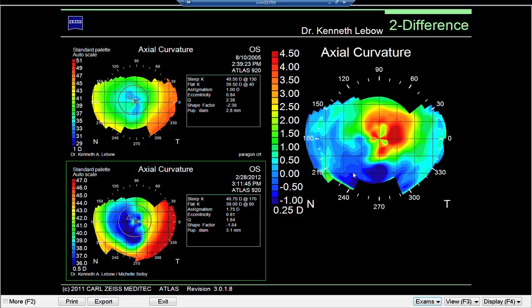This individual had refractive surgery, and the result of the refractive surgery was actually rather poor vision. We needed to fit a reverse geometry rigid gas permeable lens to the eye. This is how I would monitor over time the effect on the eye.